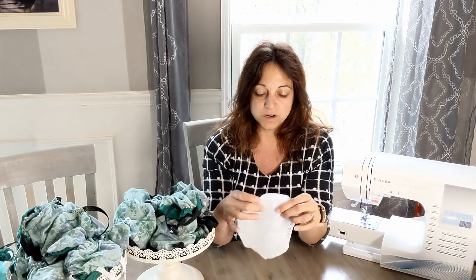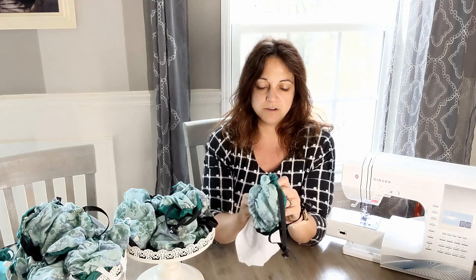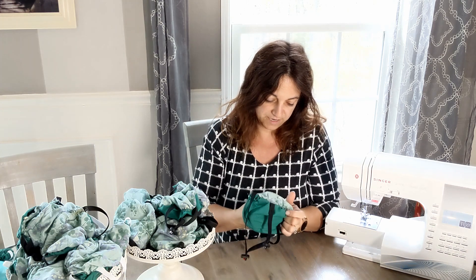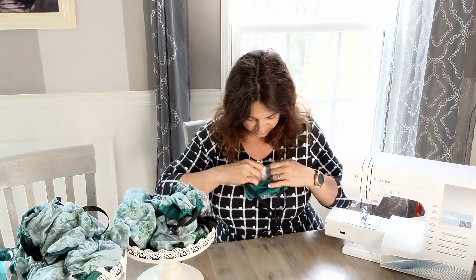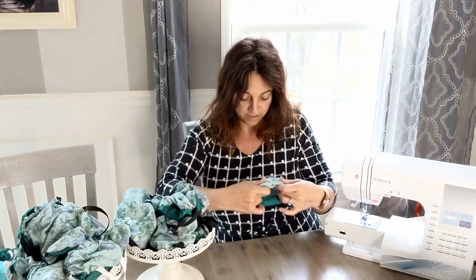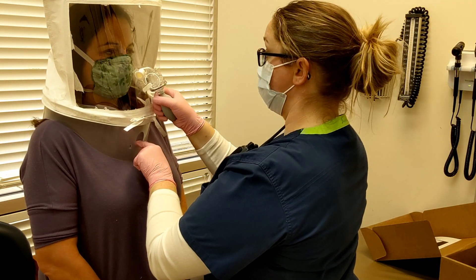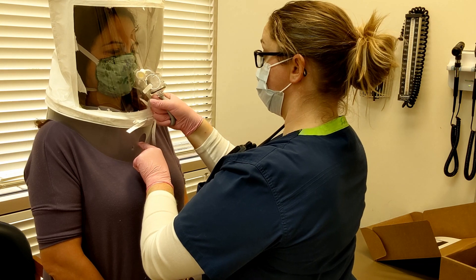When you put this filter in your mask, you want to stuff it just like a duvet. Grab the corner on the bottom, find your bottom corner of the mask — that's where the bottom piece of elastic is — then go to the top side. On the inside, I just want it to smooth and flatten all the way through so there's no area of fabric without filter material. When I did my fit testing, I tested seven masks on myself and one of them failed. When I got home, I found I had my filter bunched up on one side, so there was an area of just cotton, and that obviously failed the fit test.